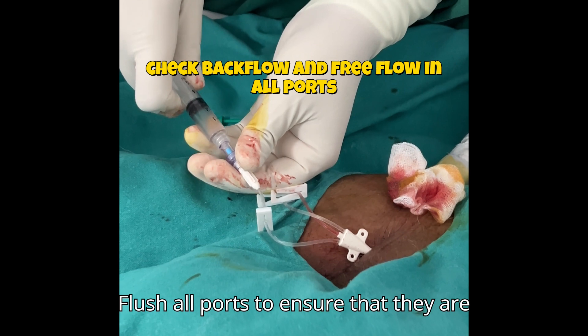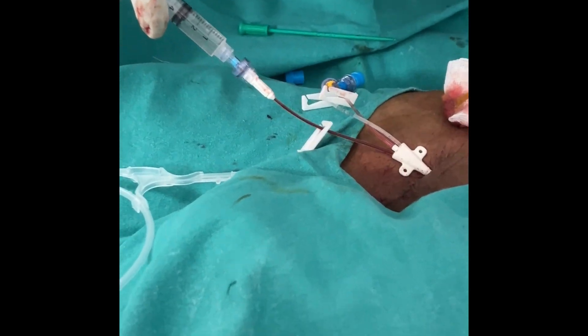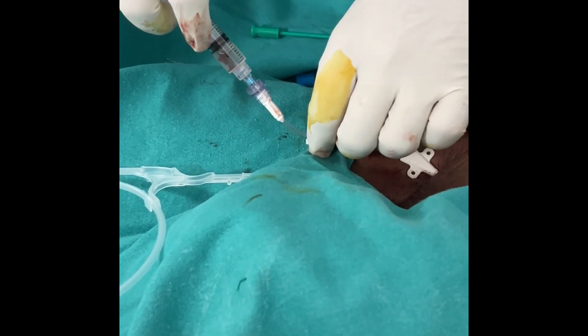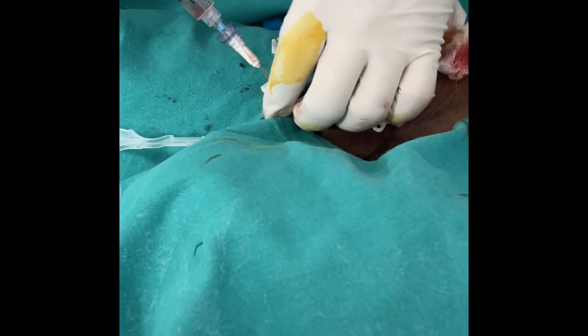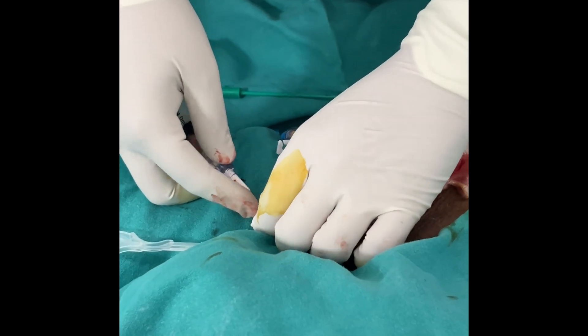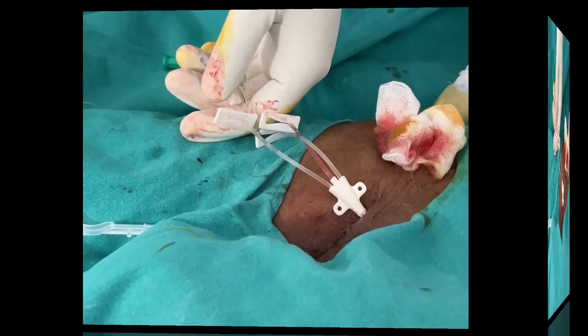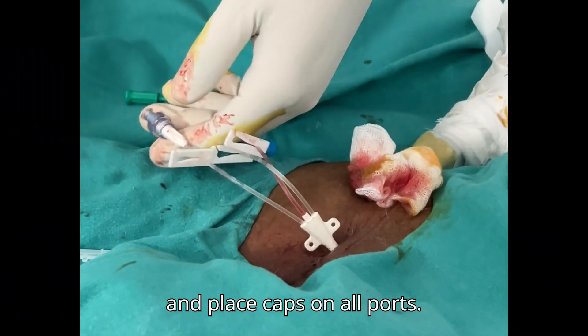Flush all ports to ensure that they are functioning properly, and place caps on all ports.